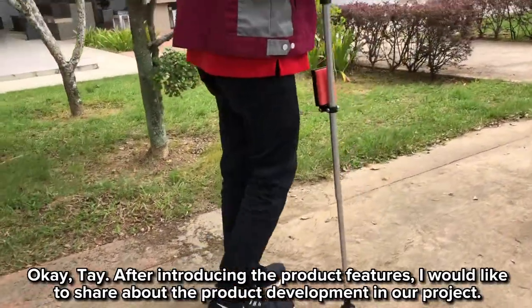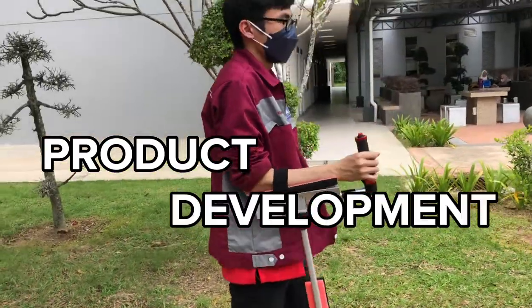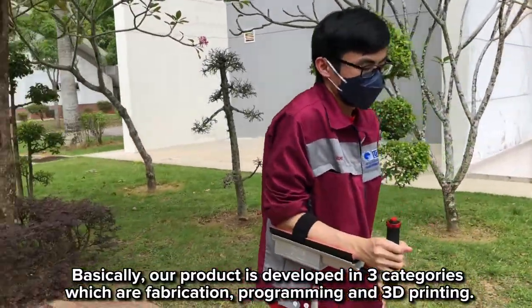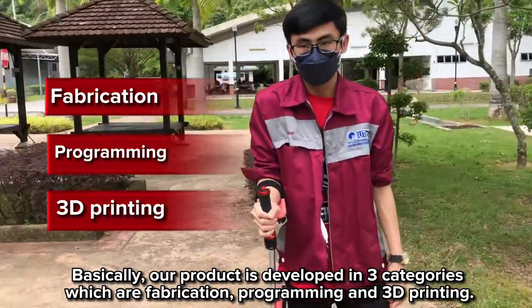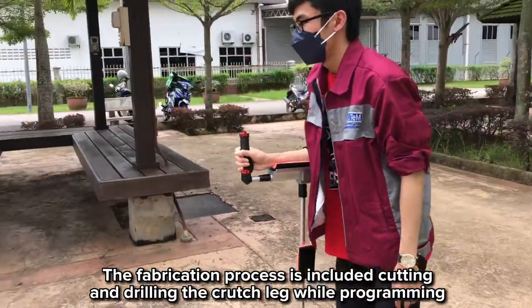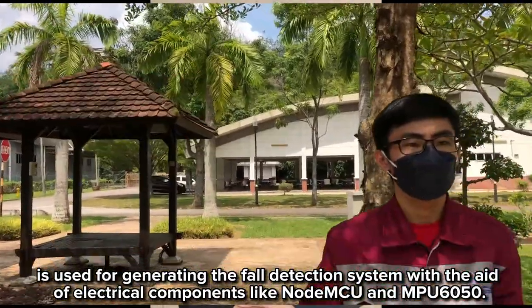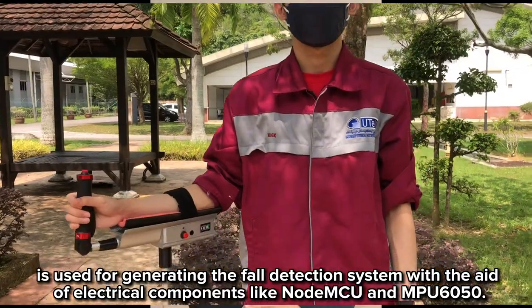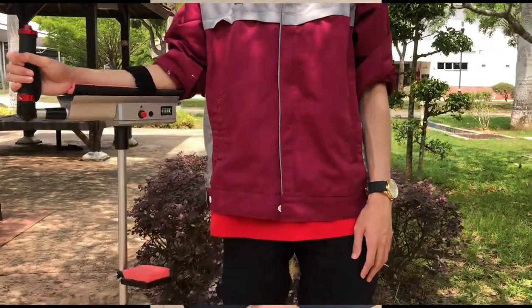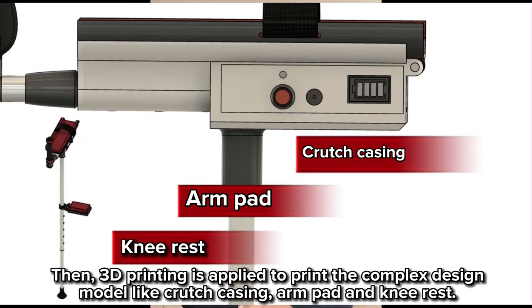After introducing the product features, I would like to share about the product development process. Our product is developed in three categories: fabrication, programming, and 3D printing. The fabrication process includes cutting and drilling the crutch legs, while programming is used for generating the fall detection system with the aid of electrical components like the MCU and MPU-6050. 3D printing is applied to print component design models like the crutch casing, arm pad, and foot rest.